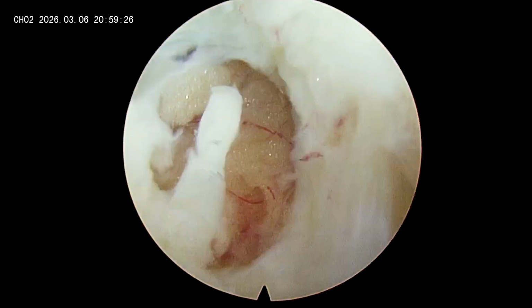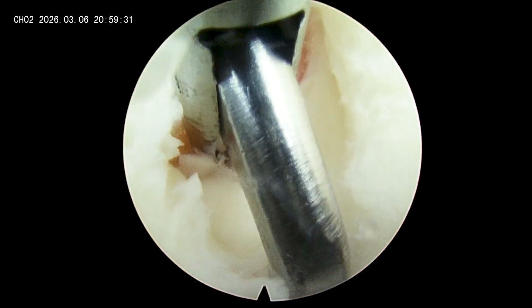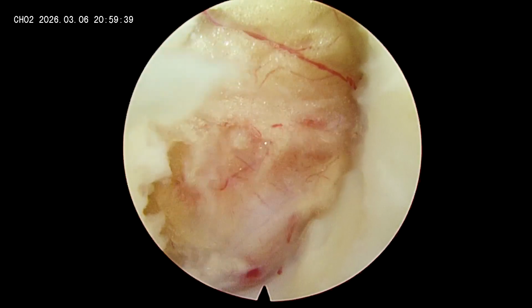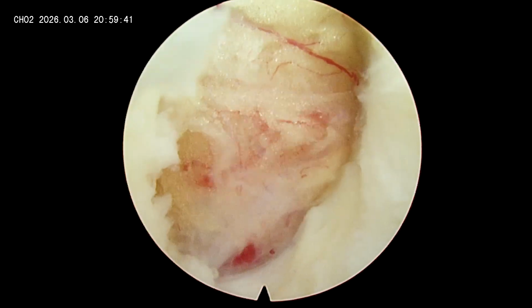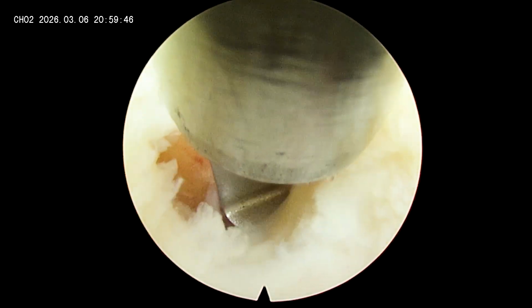So now I'm just cutting the ligamentum flavum layer by layer, stretching it and cutting it. Stretch it and cut it. By doing so, you are just pulling the ligamentum flavum away from the neurological structure. Now here I am using the tube sheath punch to cut the remaining ligamentum flavum here.